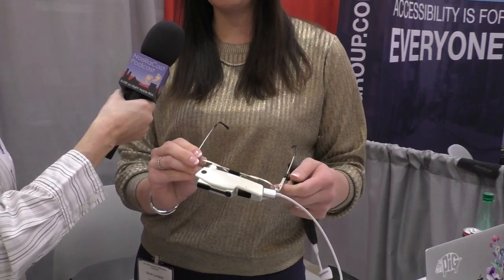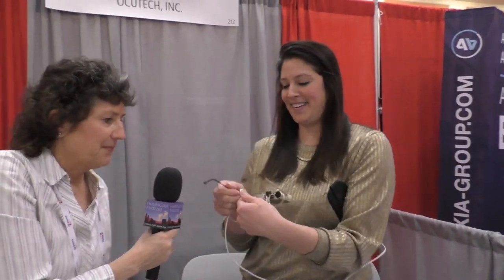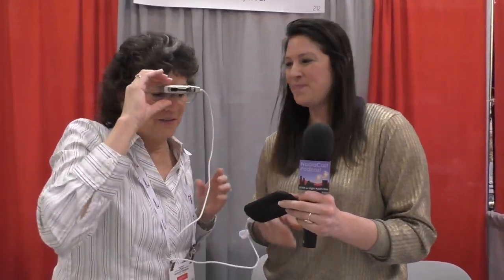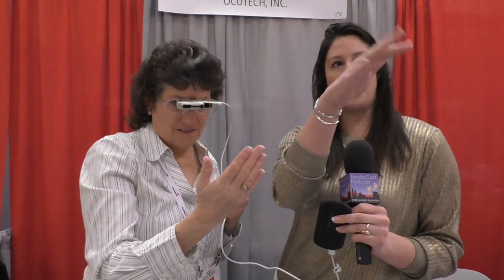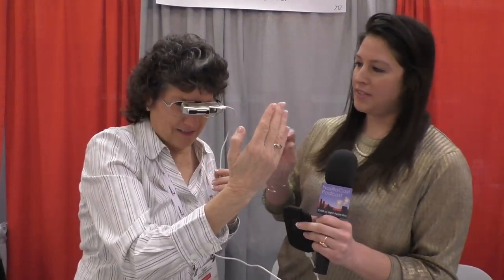It uses infrared technology. It focuses almost immediately from 13 inches to optical infinity. I'm looking at my ring — I've got my ring in focus — and I'm going to switch and look at Steve. And Steve is in focus. That's really fast. Yes, it works.